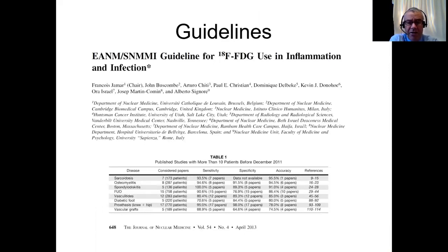Now, these are our guidelines of when we think we should be using this. And this is based on a reasonable number of patients. Now, these guidelines are nearly 8 years old now. So probably they need redoing, not by me, but hopefully by somebody else, because there's now a lot more data, which really helps to demonstrate where FDG is useful.